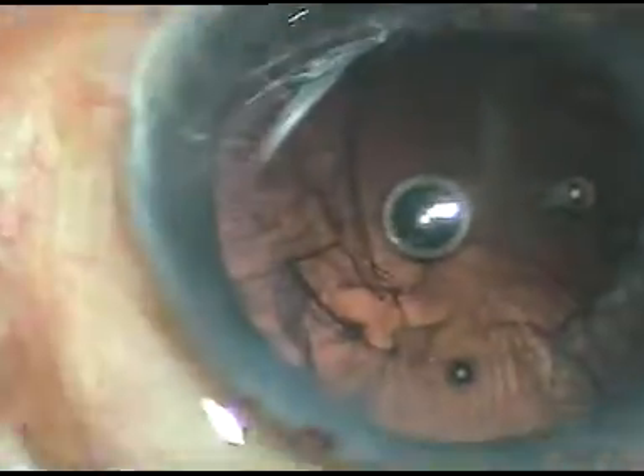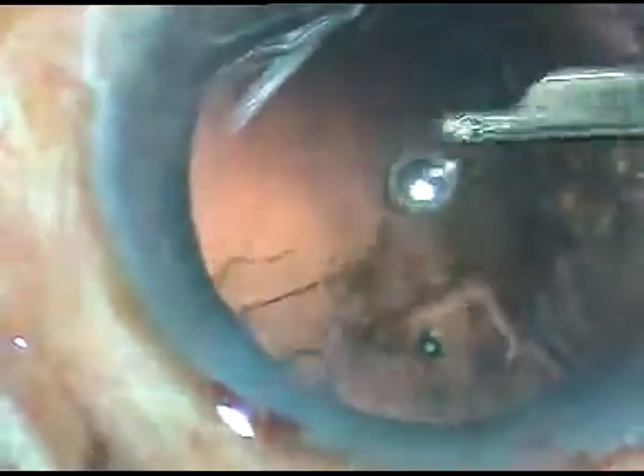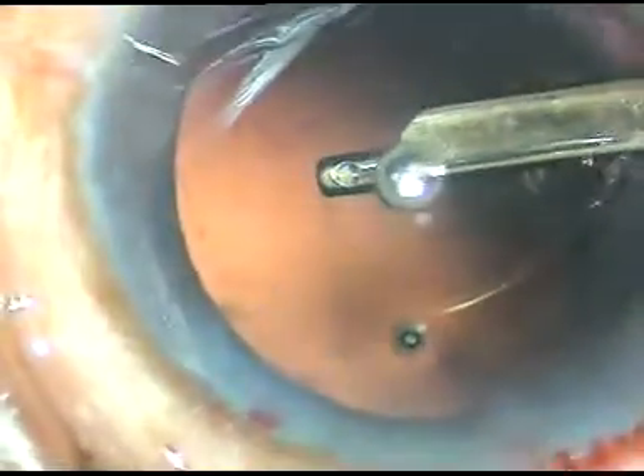Now we can see that the rhexis is quite round. A bit of viscoelastic has been injected. Now cortical cleanup is being done. It doesn't matter what you use — whether you use a coaxial I/A or bimanual I/A, or this very simple instrument, the Simcoe cannula — it doesn't matter. You have to clean the cortical matter all around very nicely. There should not be any cells sticking to the posterior capsule. The posterior capsule should be polished. Sometimes I use the jet of the irrigating probe to polish the posterior capsule.